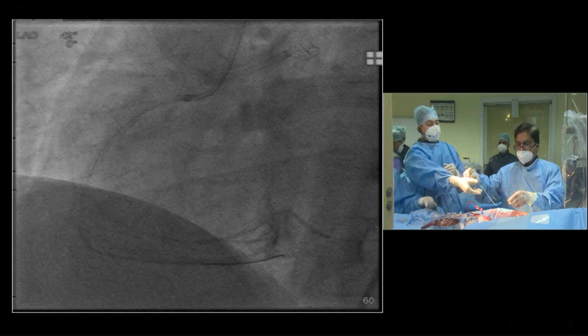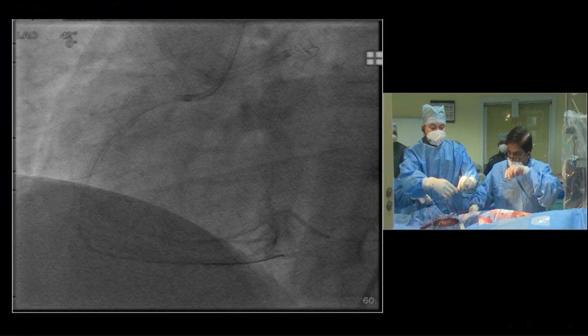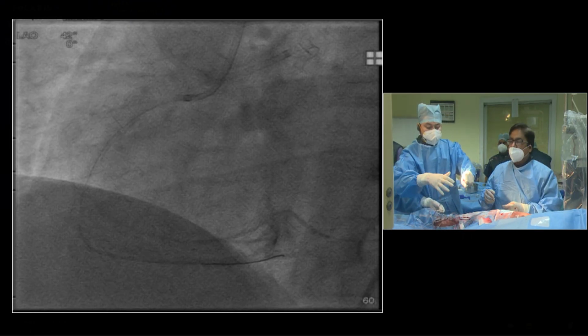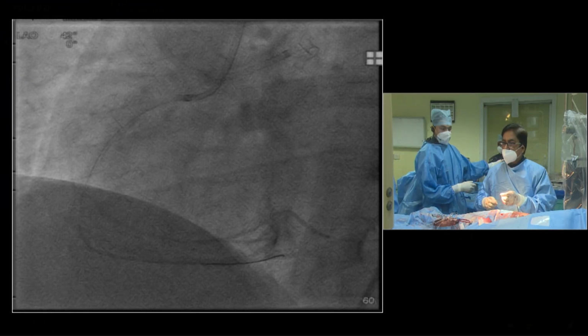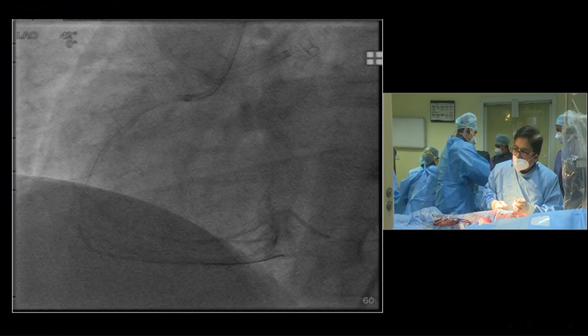Goel sir, only 10 minutes more actually. Now I will get this completed. Give me a 20 balloon please. So I think the main work is done. It's probably just the wiring. If you can just show us the wiring into the true lumen, into the distal vessel. But actually there are two things and I will come back to it.